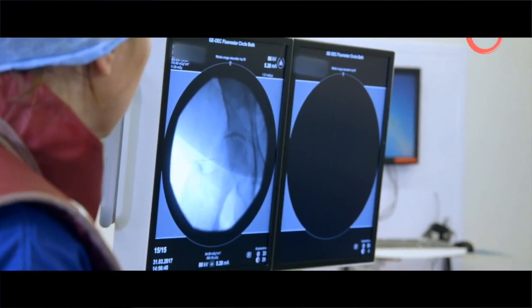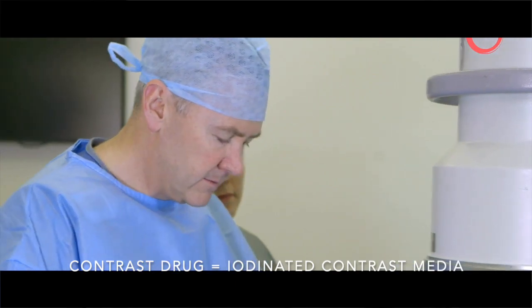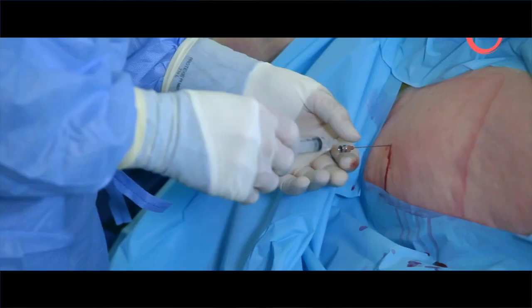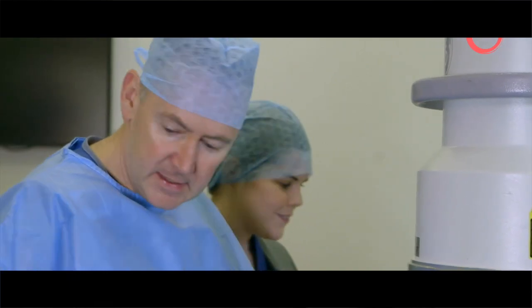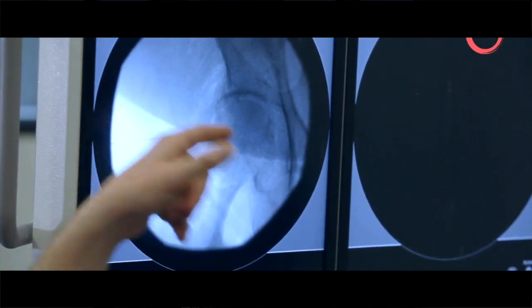But we also want to prove that it's definitely in the joint, and in order to do that we inject a contrast medium to ensure that we're in the right place, and that can be something as simple as air, or it can be a contrast drug that we inject. So now, Jean, I'm going to inject a little bit of air just so that we can prove we're in the hip joint. Flash there, please. Lovely. Save me a copy of that, please. We can physically see the inside shape of the joint that identifies positively that we're in the hip joint.